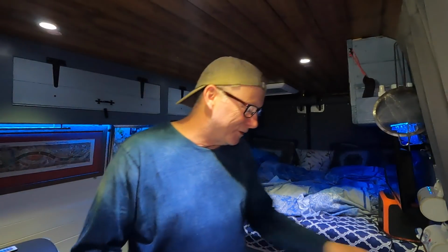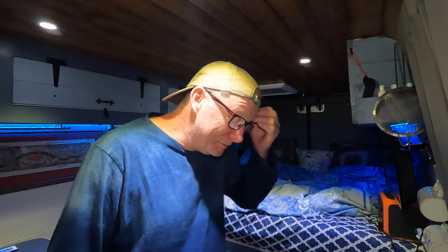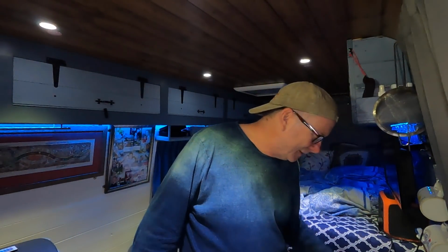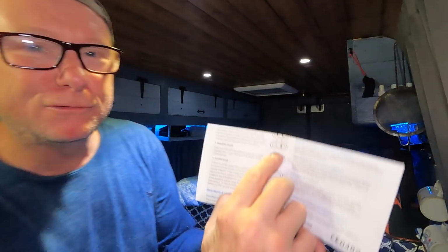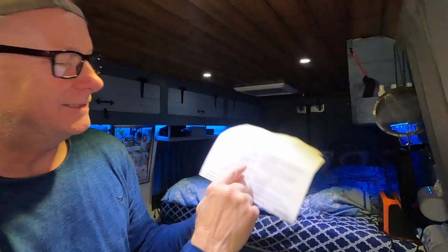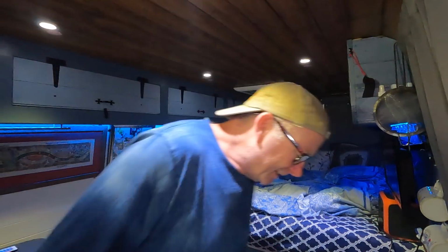I'm just doing this purely because I've never seen this done before, and I thought I'd make a little quick video all about it. Right, we've got 51 seconds to go, and it's still only got one line. I'll bring the camera down in a minute and show you. I just want to do it spot on 10 minutes. Because the results, it does show on here a little grey line, so you might get a little faint line if it's positive, or you'll get two solid black lines there. So this is what we want, a complete clear above the T, and it's still clear, and I've got to say I'm really relieved.